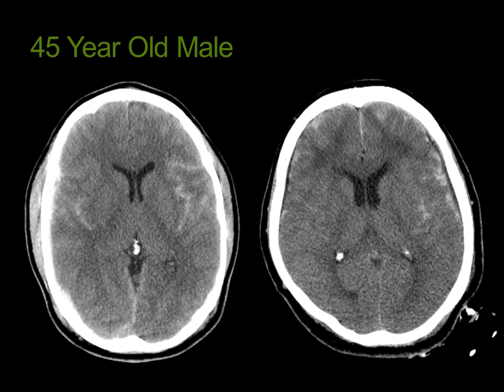This is a 45-year-old man with diffuse acute subarachnoid hemorrhage, seen as hyperdensity throughout the sulci. Acute subarachnoid hemorrhage can result in communicating hydrocephalus, which can quickly affect intracranial pressure. Of note, the subarachnoid space is clearly delimited on this example due to the overlying thin subdural hygroma.